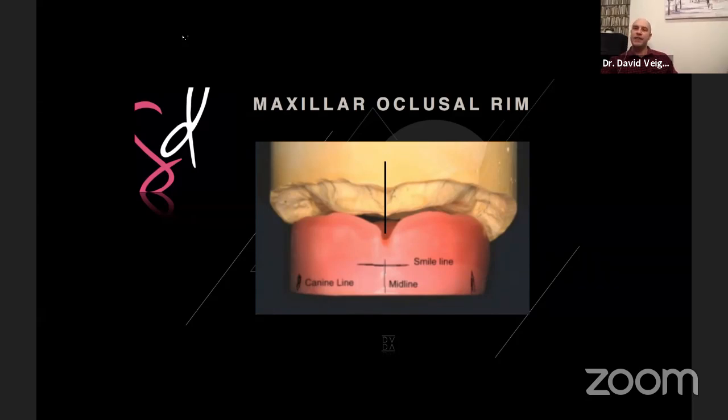How we're deriving that value is, if you think of a natural central incisor, it's anywhere between 10 and 12 millimeters long. If you take from the level of the implant shoulder to that future incisal edge, you have approximately 3 millimeters of transmucosal space, plus the tooth on top of that. So a 10 to 12 millimeter tooth plus a 3 millimeter transmucosal space gives you a 15 millimeter restoration from the implant shoulder to the future incisal edge.